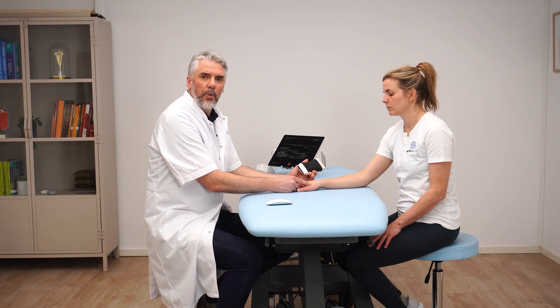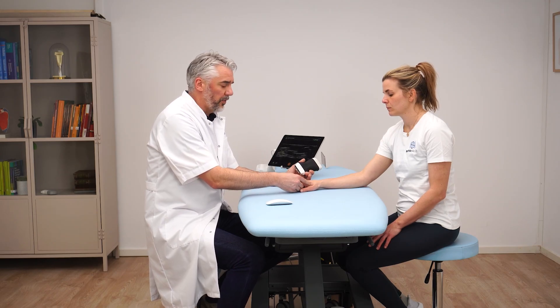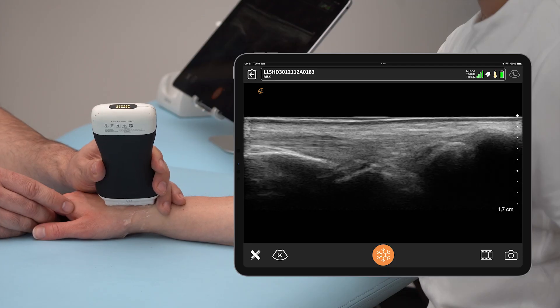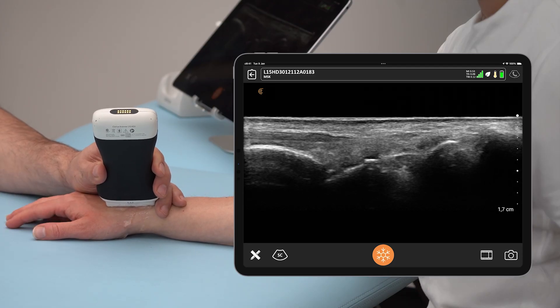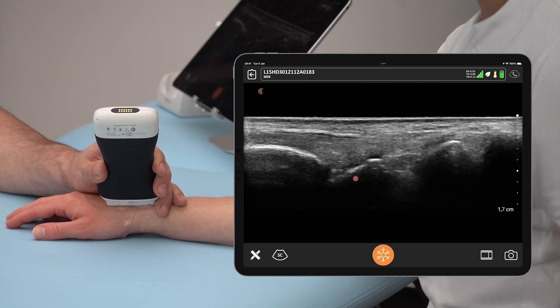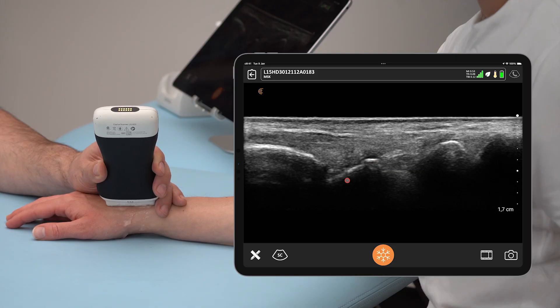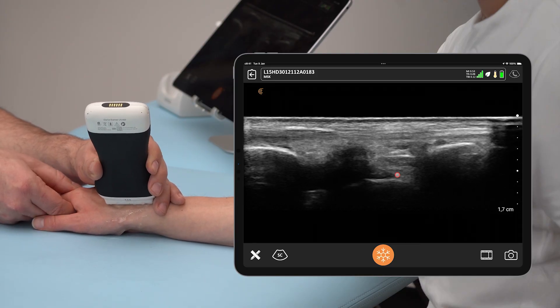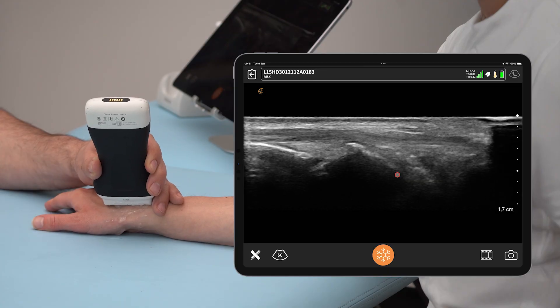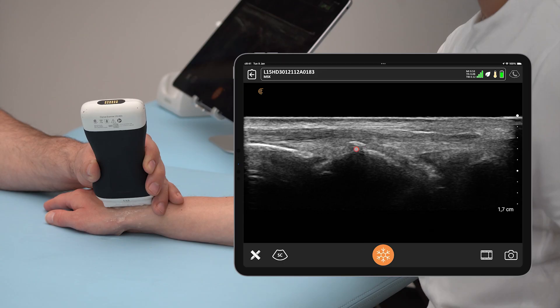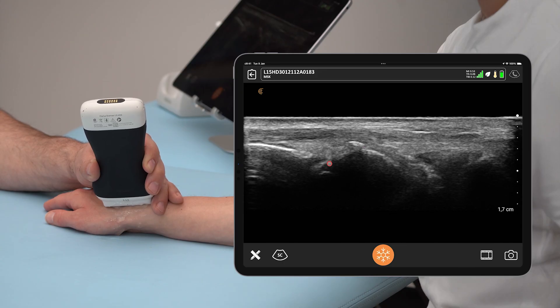Before doing the ulnar deviation, I will first start in neutral position so that you can see the difference. Placing the transducer over the scaphoid, we can see the radial bone right here and here we can see the scaphoid. When the patient ulnar deviates the wrist, you can see much more of the bone which would usually be hidden.